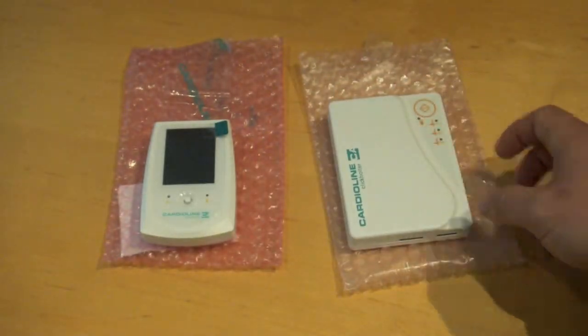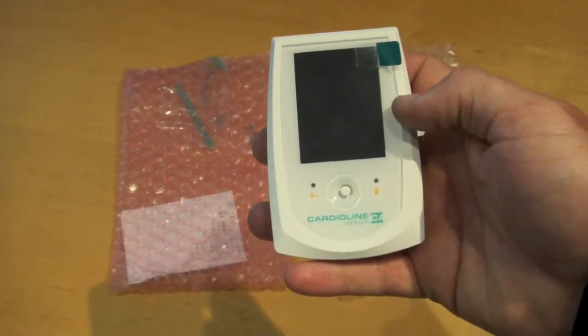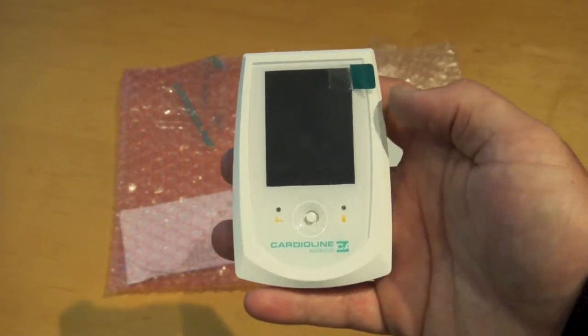The more advanced Walk 400 Bluetooth Holter adds a couple of unique features. The first is a preview screen — it is color, and the unit is a little bit more compact in size.